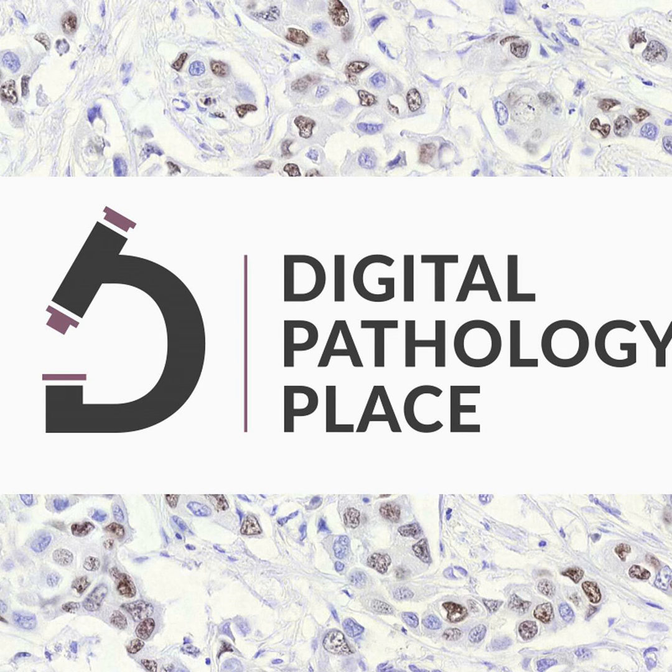So yes, that's what FDA says. FDA says yes. Written procedures should be in place. They might include scanning, validation, training, maintenance, software version control, backup, disaster recovery, everything. But this everything, do not be terrified. This everything is what you usually do for any computerized system and for anything in GLP, good laboratory practice. You have to protect from all this stuff, from virus protection even, and disaster protection, anything. So yes, the answer is yes.